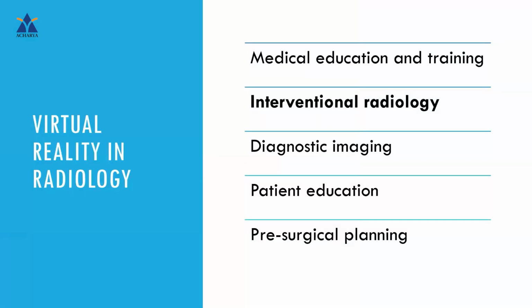And then now we'll see about how VR is used in radiology. So virtual reality can be used for medical education and training, for interventional radiology, for diagnostic imaging, for patient education and pre-surgical planning. So in medical education and training, for the PG students or the medical students who are interested in knowing about what radiologists do, you can use these VR systems to give them an idea on what exactly happens in the department and what are the different procedures.